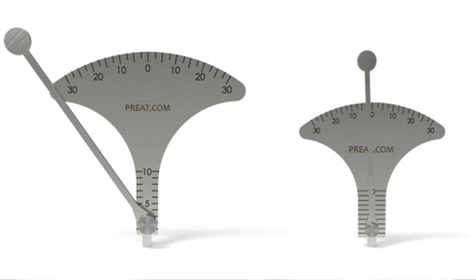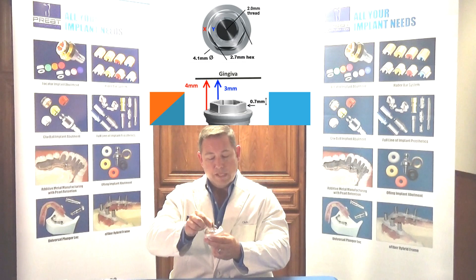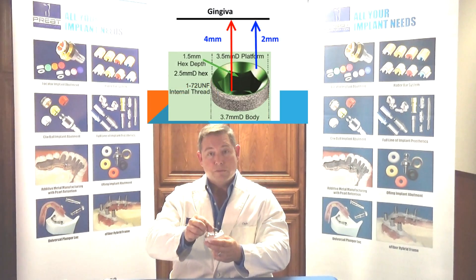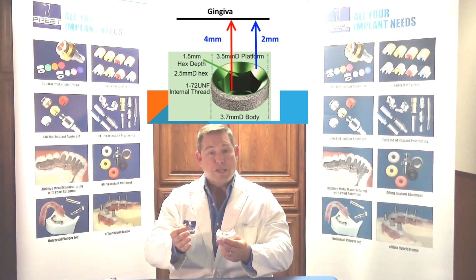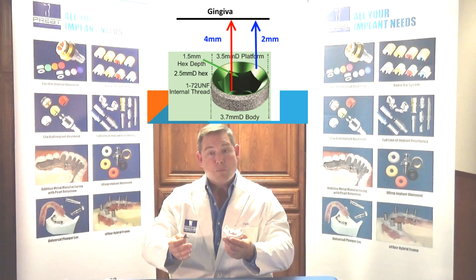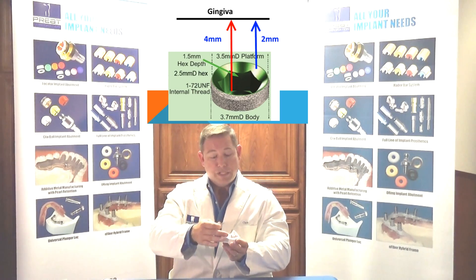This is the new Preet Cuff Height and Angulation Tool, and it's very simple to work with. You place it directly on top of the implant platform. When measuring external hex implants, place it onto the platform, not on top of the hex — if you place your measuring tool on top of the hex, your cuff height is going to be too low. For an internal connection, if you drop the measuring tool down inside that hex, a common hex height of 1.5 millimeters means you'll end up with an abutment that's 1.5 millimeters too tall.